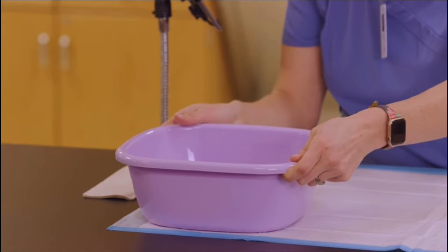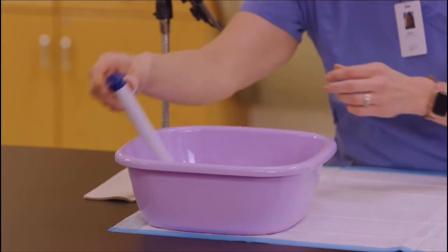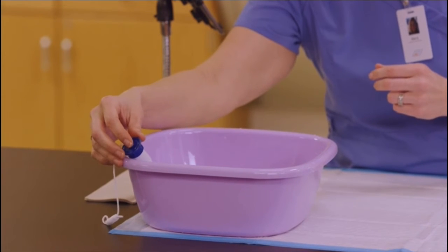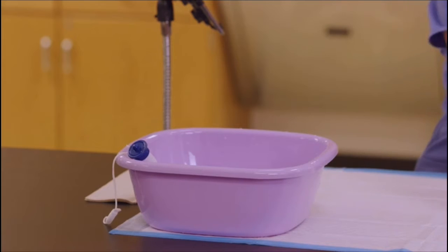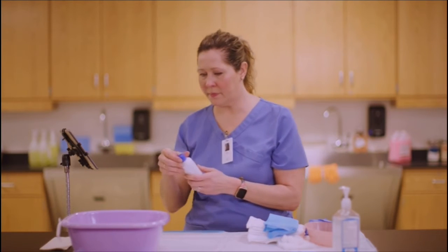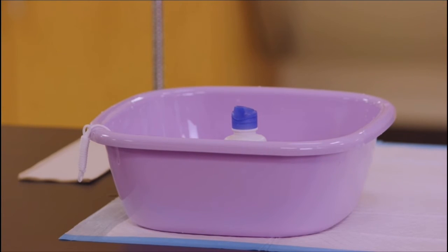Prior to the procedure, prepare a basin of warm water. The temperature should be around 98.6 degrees Fahrenheit, or 37 degrees Celsius. Use a bath thermometer to check the temperature. Recheck the label of the irrigation solution for a second time, comparing to the order. Then, submerge it in the basin of warm water, protecting the label.